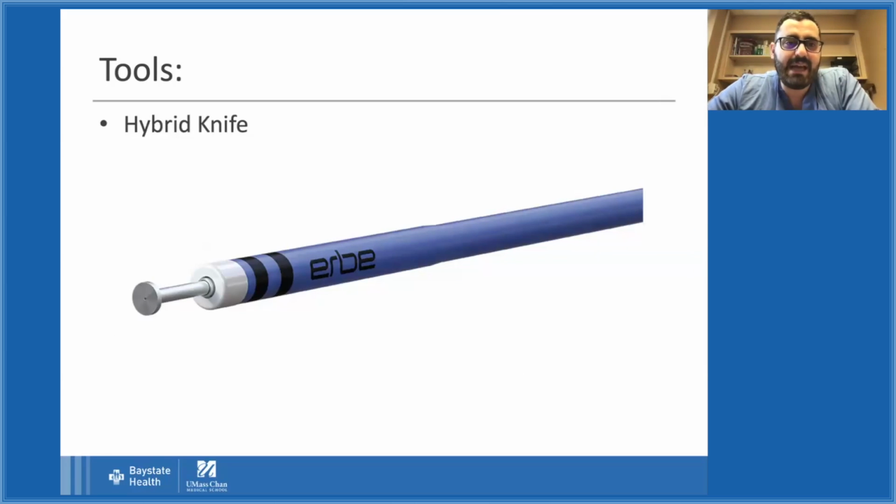And then there is this knife. This is not like a sharp knife that we see in the kitchen, but it's a metal part that cuts with heat. Okay, and then if you can focus here, you can see this small hole where we can inject fluid through the knife into the tissue, into the submucosa that we talked about earlier.